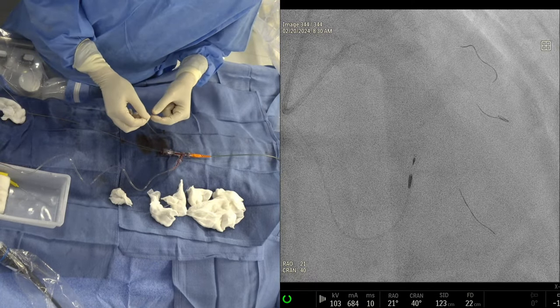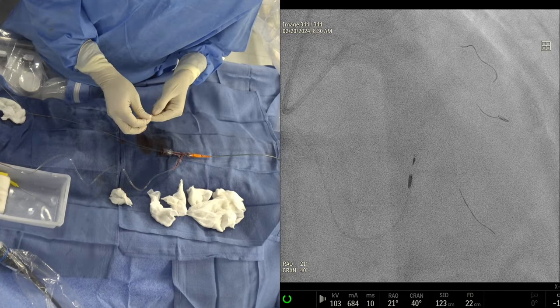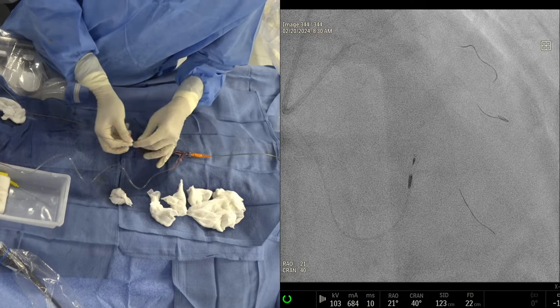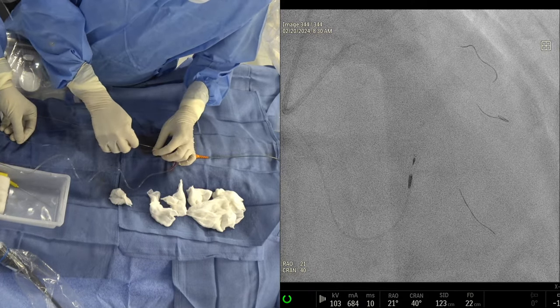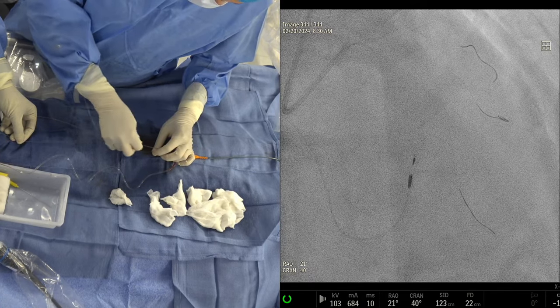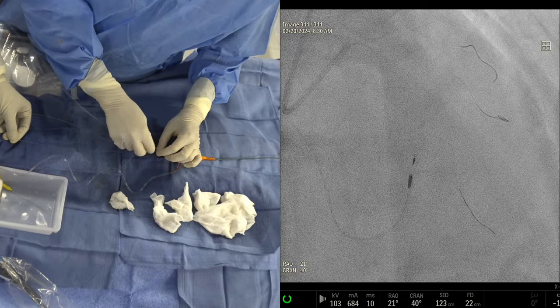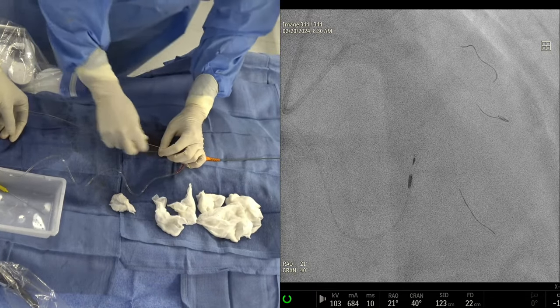We're cutting balloon for D1 now, right? If you rely only on angina, we'll miss a large number of the population. We also learned from the ISCHEMIA trial that ST segment depression on stress test didn't make much difference. So, coming back to the point, symptoms alone are not enough. If you have risk factors, you need to find the coronary anatomy the patient has, and that is the CTA.